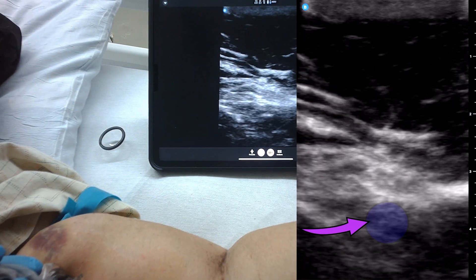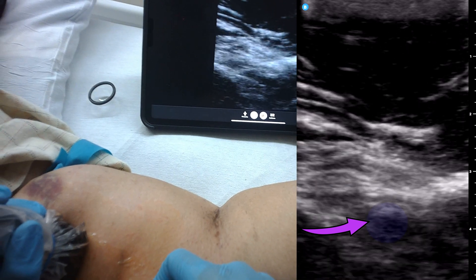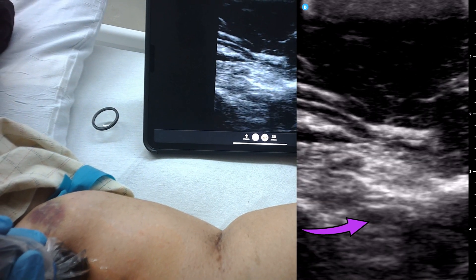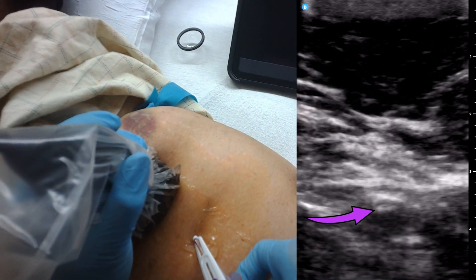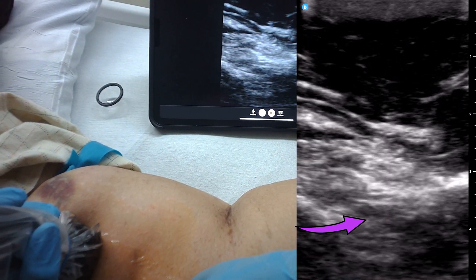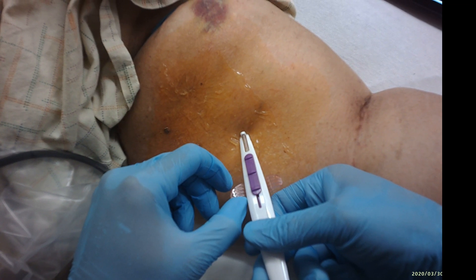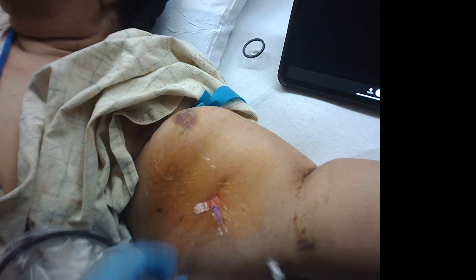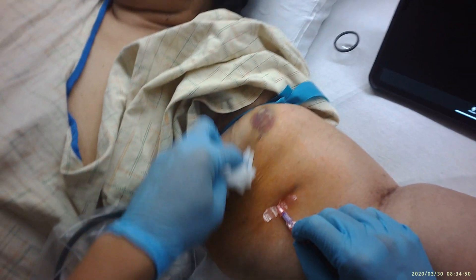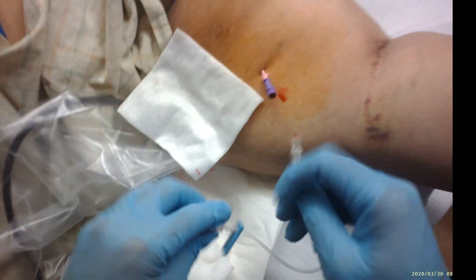I just need to — I could feel that. Felt that? Yeah, I could feel that. Now what I'm going to do is advance it. It feels very resistive, so I've got to be careful. Let's see how that does — I'm expecting some resistance, which I don't get. Beautiful. The reason why I expected some resistance is because it was such a steep angle, and I was afraid that the catheter wouldn't bend with the guide wire as easily. We're about to find out if it worked — and I think it did. Beautiful. Look at that blood return. Love it. Good blood return there.